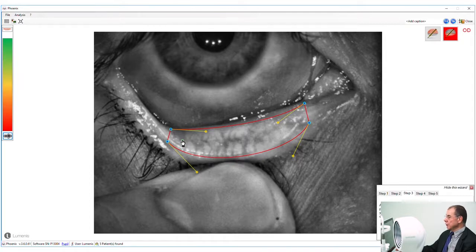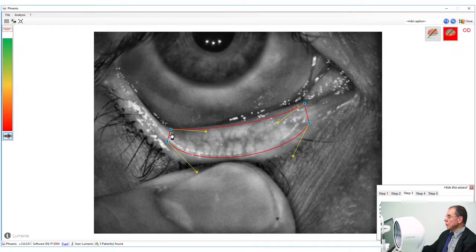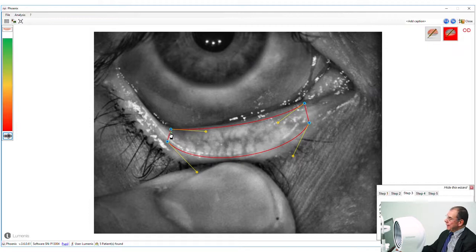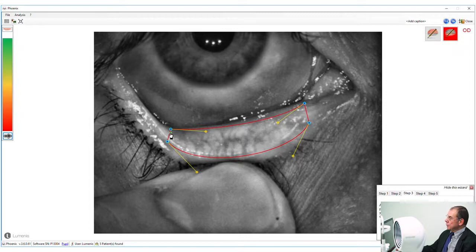The mouse has now turned into a green dot. I'm going to put it slightly low, if I put it in the corner then it disappears. The idea here is to keep the left mouse button depressed continuously and to move the mouse along the red border.